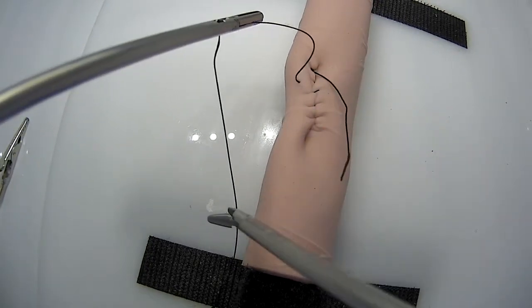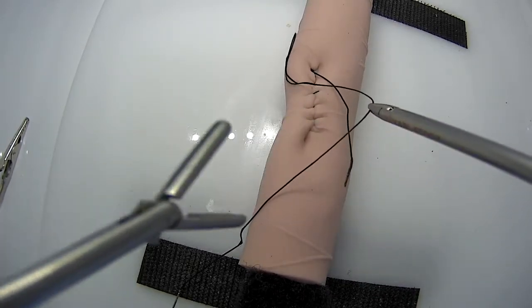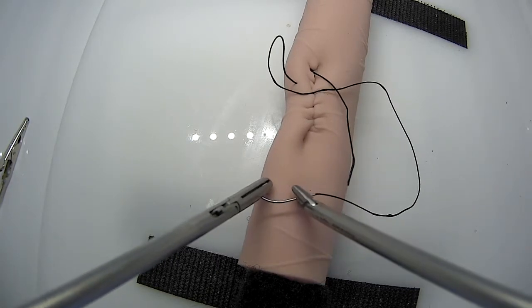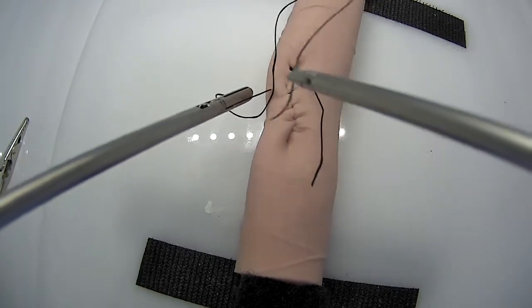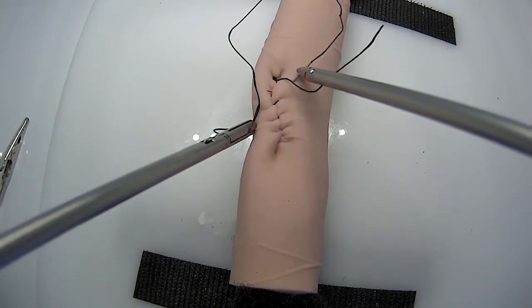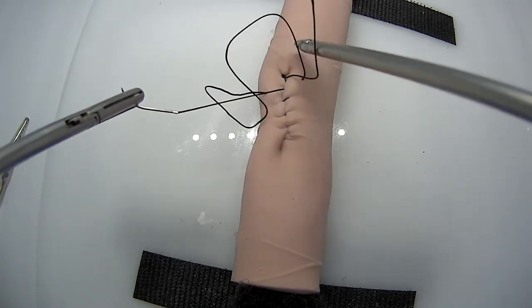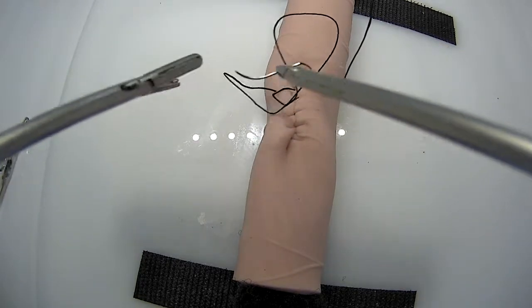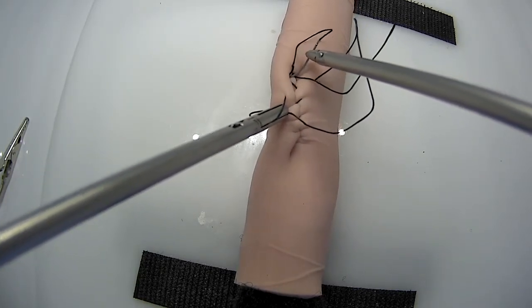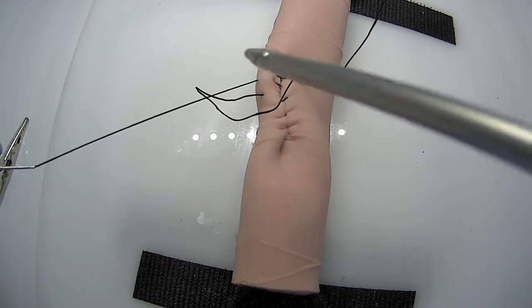Looks like we need another stitch here. We want to be next to the original tail. We're going to be tying to that. You can take these in one bite, but I prefer to take them in two to make sure we get accurate bites. Your tail doesn't get caught.